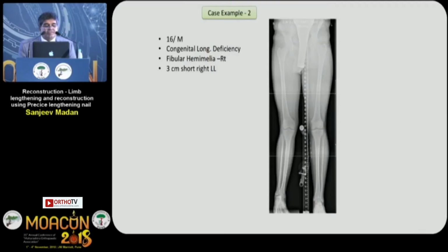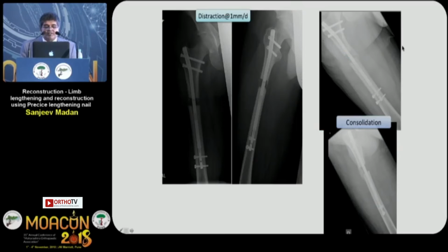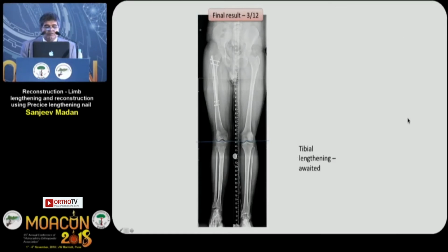So case 2 example, 16-year-old male, congenital longitudinal limb deficiency, fibular hemimelia, 3 centimeters short in total. Pre-operative planning was done, computing was done, and then the nail size was determined, and distraction was done 1 millimeter a day with locking, and there you go. So the final result, and in this case the mechanical axis was good.